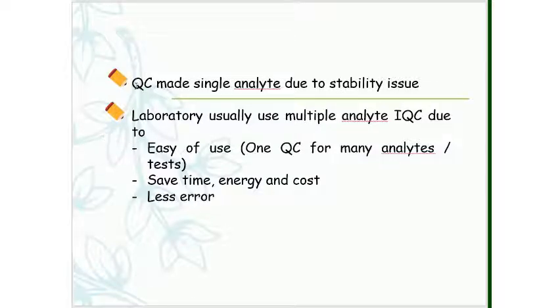So here it is. This slide explains what I have said before. So laboratories usually use multiple analyte QC due to ease of use. For one QC that has many analytes or many tests, it saves time, energy, and cost, and there is less error during handling.